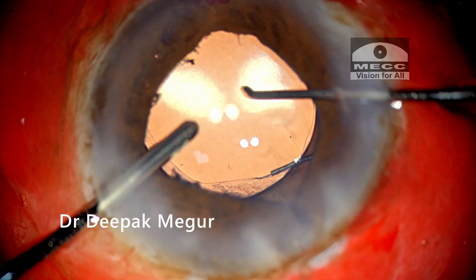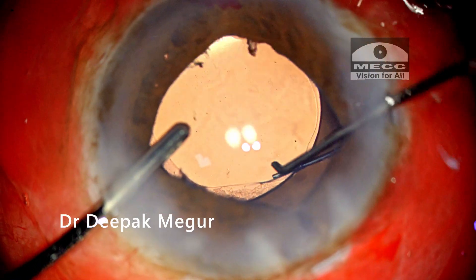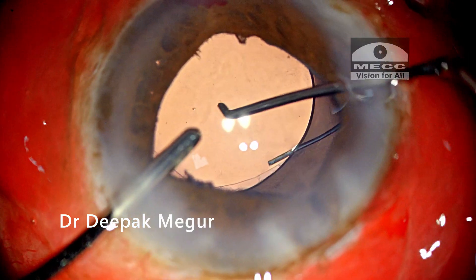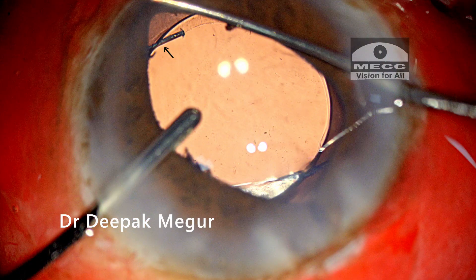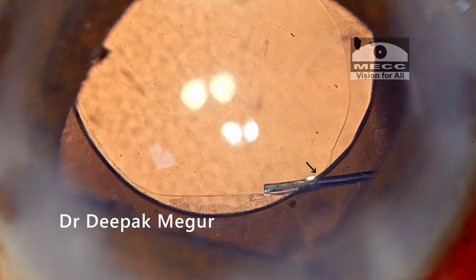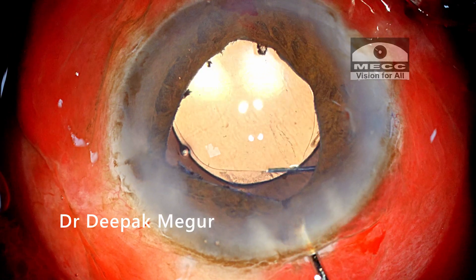Now it is time to achieve optic capture. With irrigation held in my left hand, the optic of the lens is gently nudged posteriorly so that it gets locked behind the rhexis margin. The ovalization of the rhexis margin is confirmatory of successful optic capture. I call this the IOL trap technique — my preferred method of IOL fixation in eyes with generalized weak zonules.